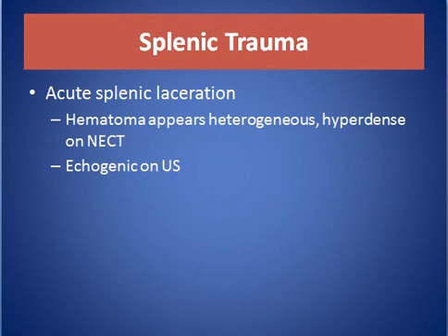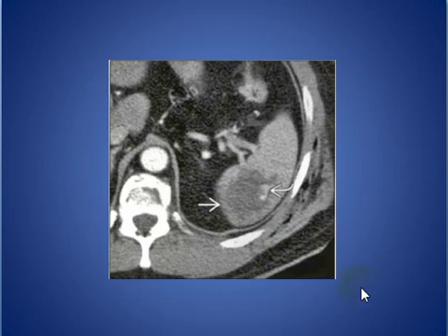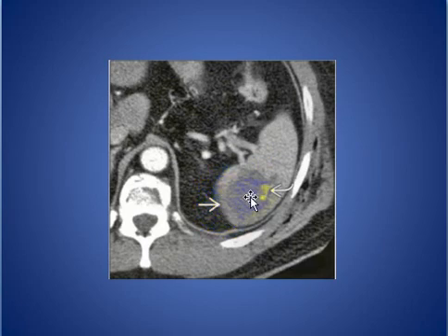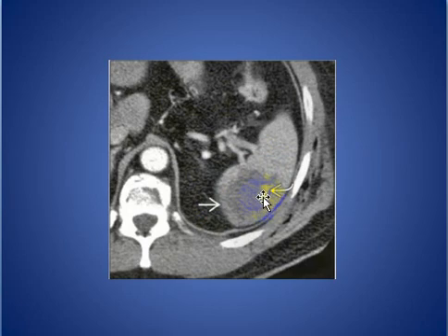Acute splenic trauma with laceration: hematoma appears heterogeneous and hyperdense on non-contrast enhanced CT scan, and echogenic on ultrasound. As seen here on axial CT in arterial phase, a hyperdense hematoma within the enhanced spleen with a focal area of increased density indicating active bleeding.